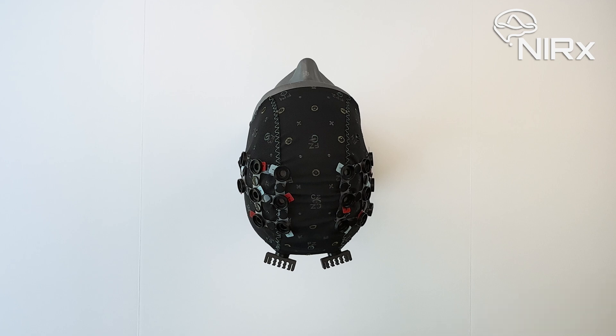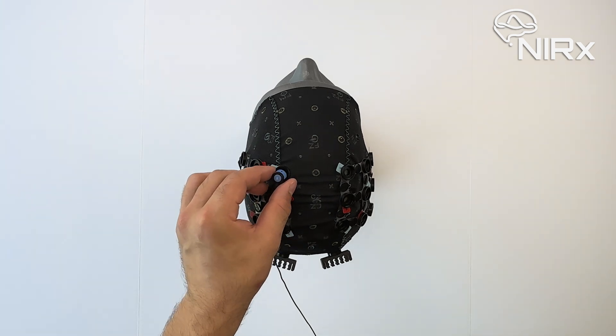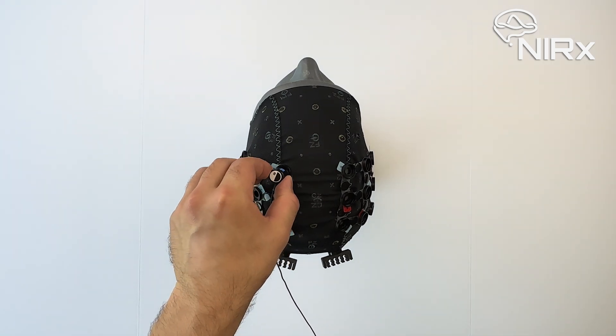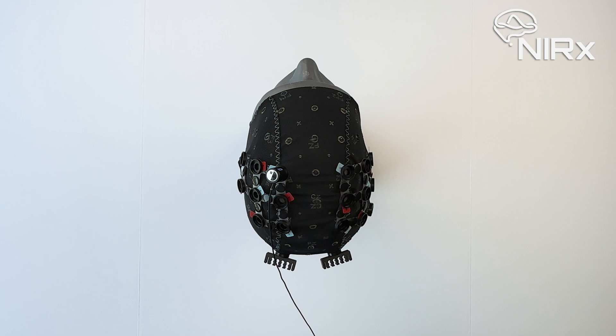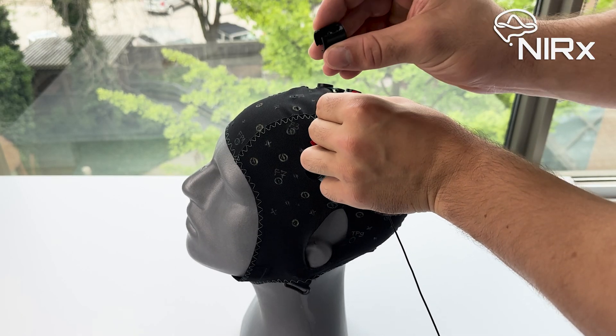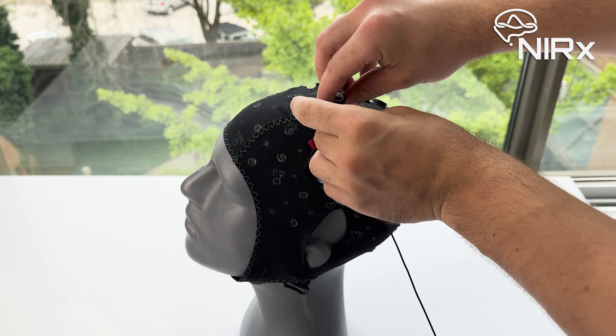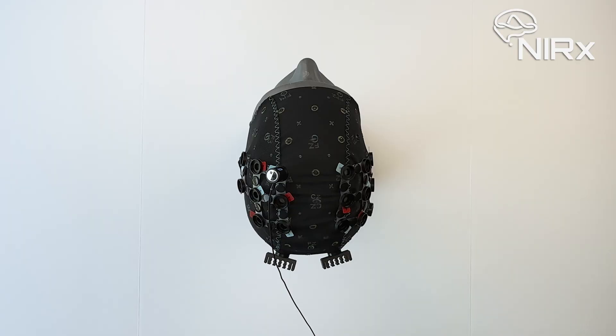We start by populating the first optode onto the cap. Keep in mind that sources are always marked in red and detectors in blue, both on your cap and in the bundle. Make sure to match the number printed on the optode with the number label on the cap, and place the optode tip in the opening of the corresponding grommet as shown. Then place a spring top of the appropriate tension on top. The spring top will click into the grommet base when properly inserted. If you're having trouble inserting the spring top, try to apply some pressure on the base of the spring top to insert it into the grommet more easily.